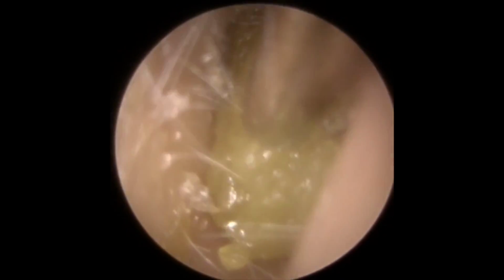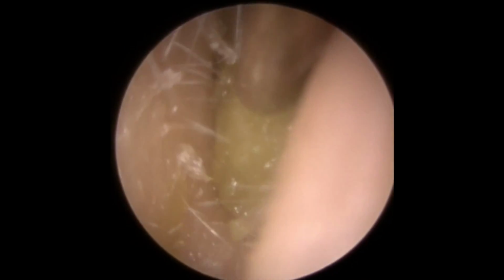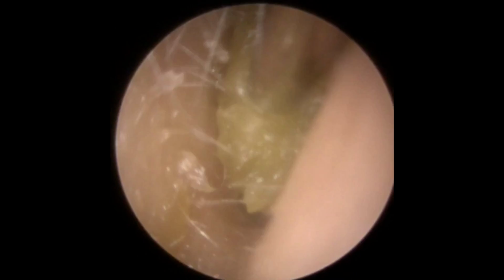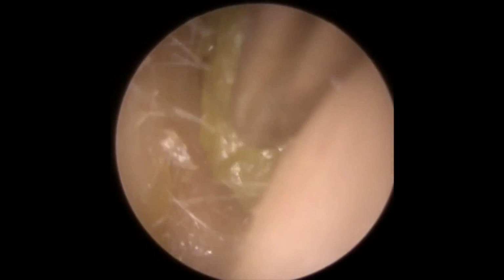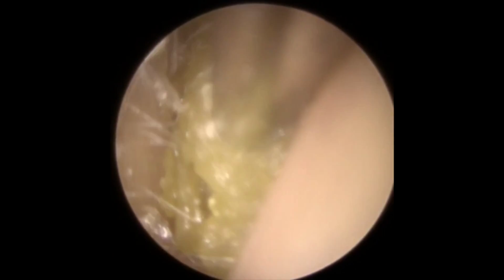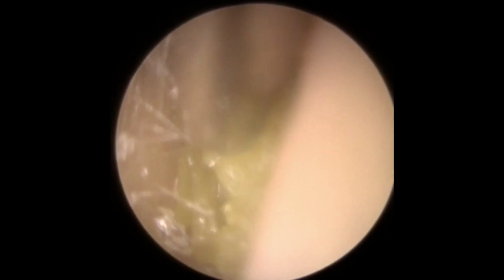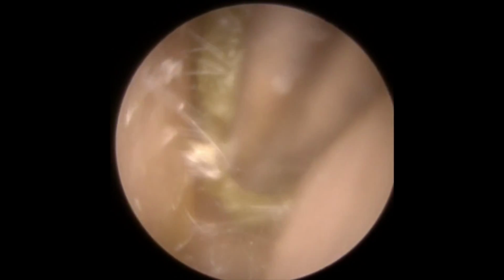Now you can see, from the videos that you've seen so far, how small these fine ends are. They are very, very small, and we can just about get that into the ear canal with a little bit of room to maneuver. The difficulty we're having here is that we've got this really large hardened up piece of wax that's sitting in the wider section of the canal, and we can only use the fine end to get this out, which is kind of worst case scenario for us as far as wax removal is concerned.